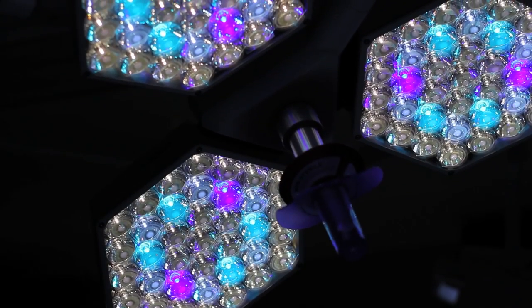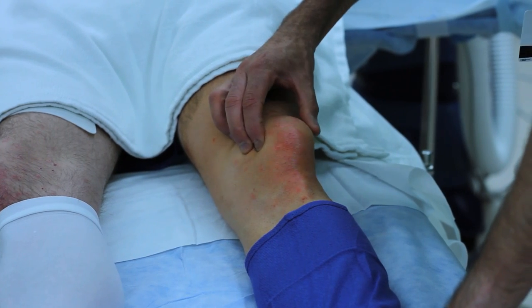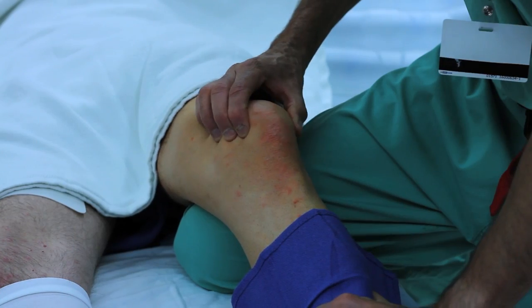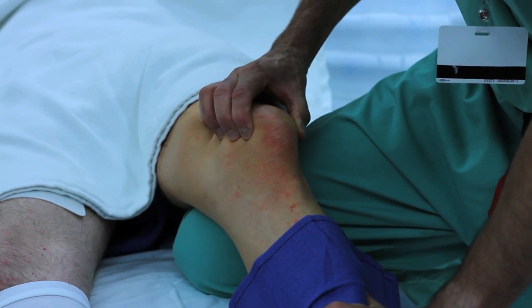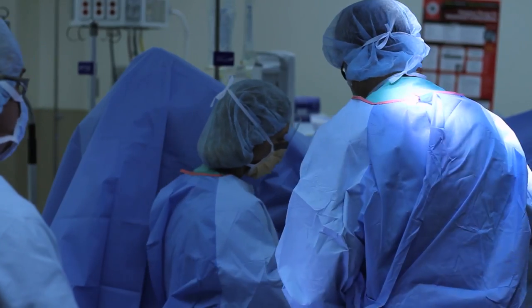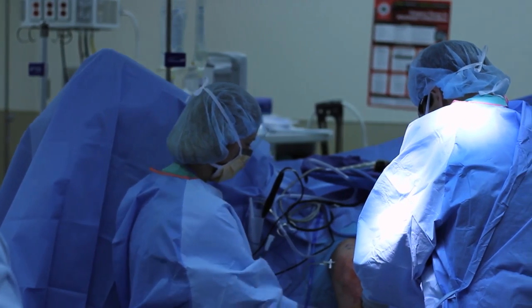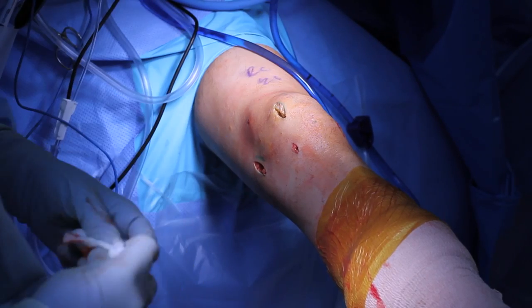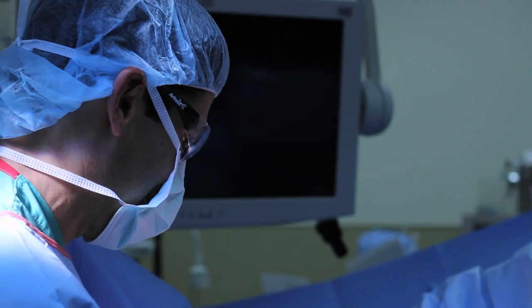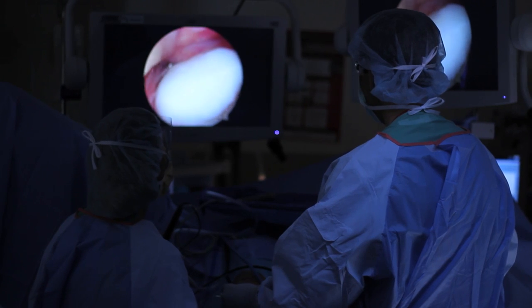Here is a case of a young patient who has had recurrent dislocations of their kneecap and presents for medial patellofemoral ligament reconstruction surgery. As you can see, I can fairly easily dislocate their kneecap laterally. It then reduces back in place. This surgery can be done by making a small incision over the medial side of the kneecap and another small incision over the femur. For this case, I utilize a donor hamstring tendon, which incorporates well into the surrounding tissues, as there's good blood supply to this area.